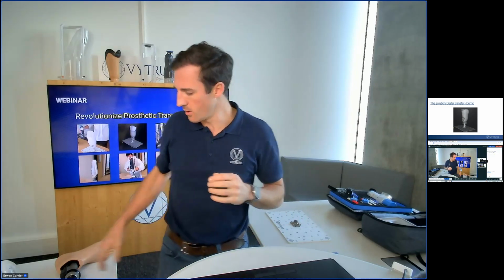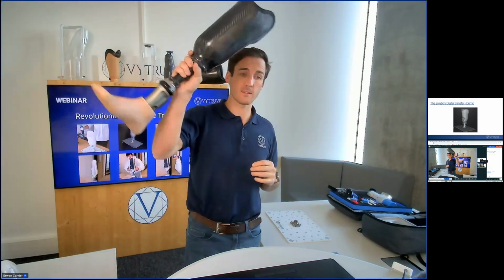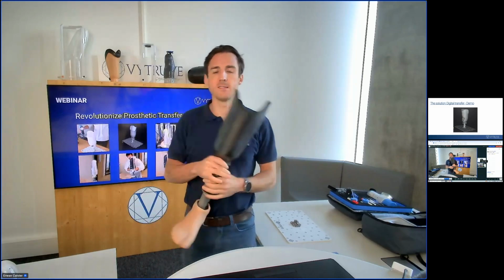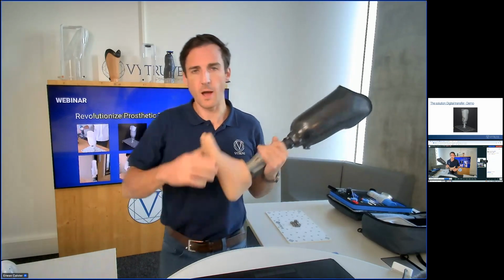So it's great to talk to you, but the best is to do a demo of what happens with this digital transfer. So we are going to transfer this socket. It's easy with a TF because the socket is big, but it's not easy for TT. So that's why I will transfer a TT socket. I will follow all the process in Vytruve.